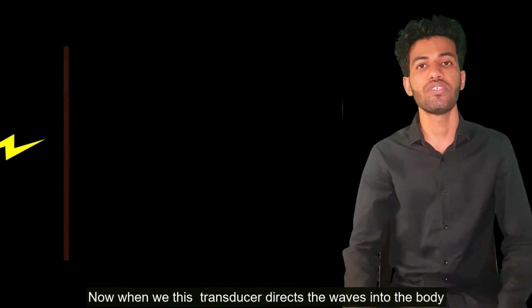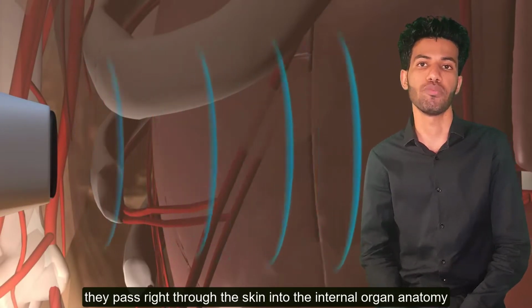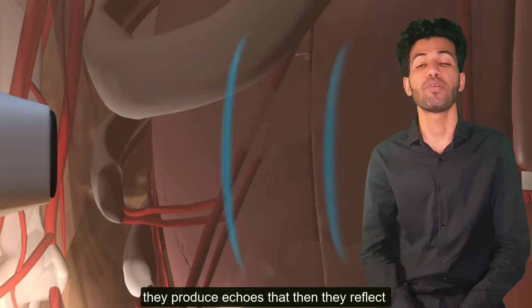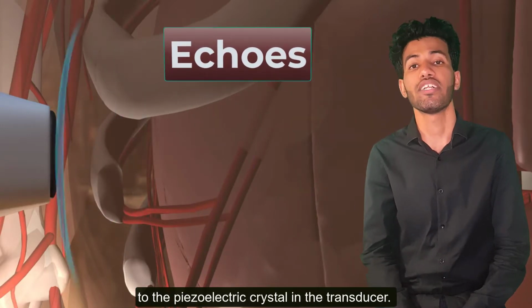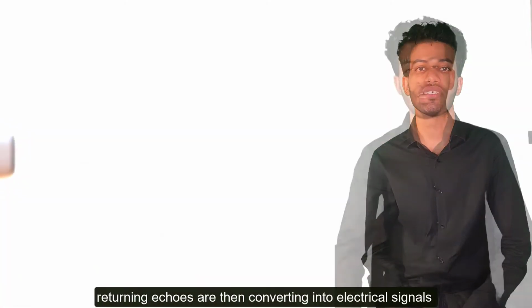Now, when this transducer directs the waves into the body, they pass right through the skin into the internal organ anatomy. As the waves encounter tissues with different characteristics and densities, they produce echoes that reflect back to the piezoelectric crystals in the transducer. This happens more than 1,000 times a second.